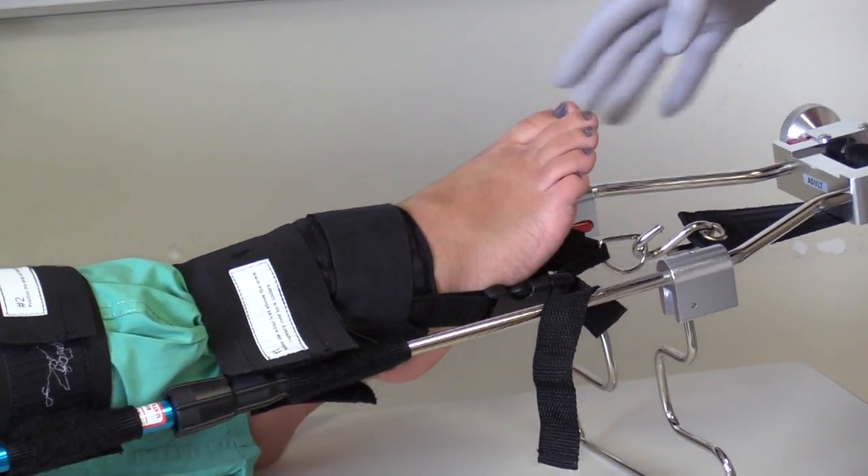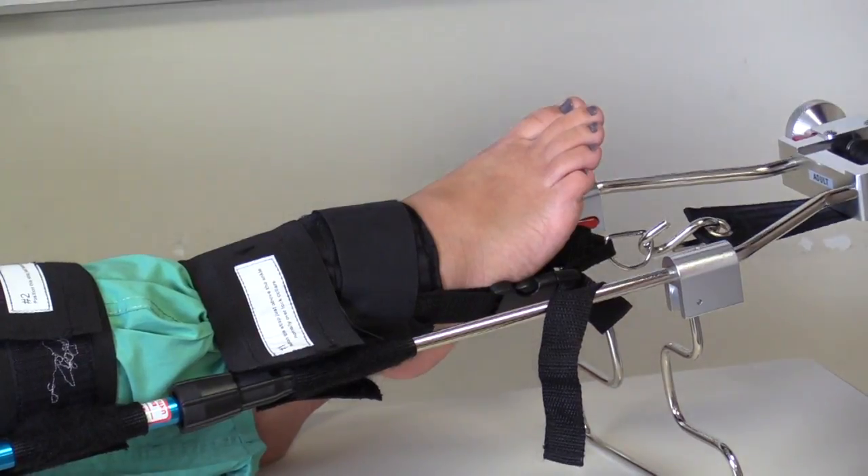I will then reassess the pulse, motor function, and sensation of the extremity. Properly treating a closed mid-shaft femur fracture with a traction splint is an important skill of the EMT.